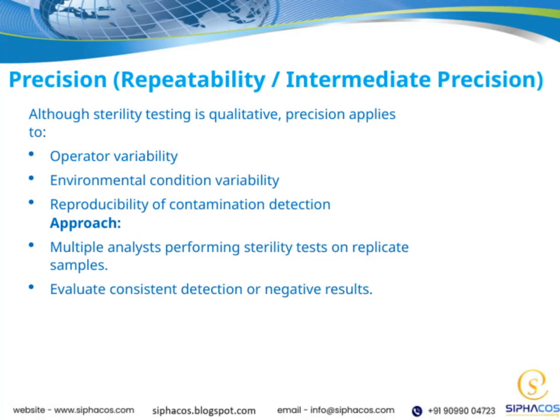Although sterility testing is fundamentally a qualitative process, it's important to understand that precision still plays a vital role. When we talk about precision here, we're referring to how consistent the results are, despite some inherent variability.